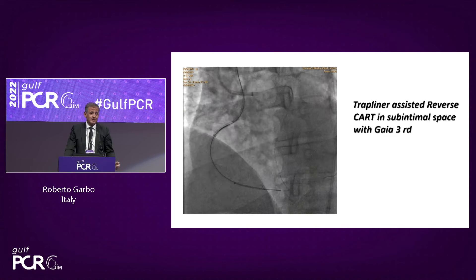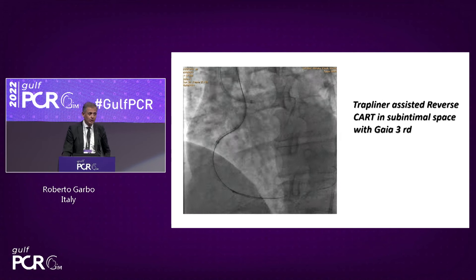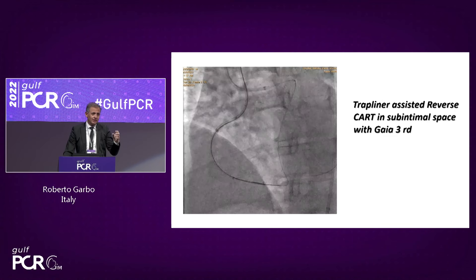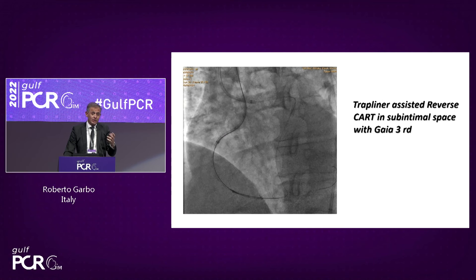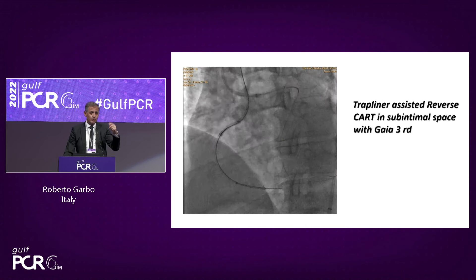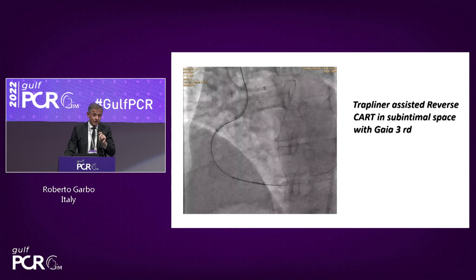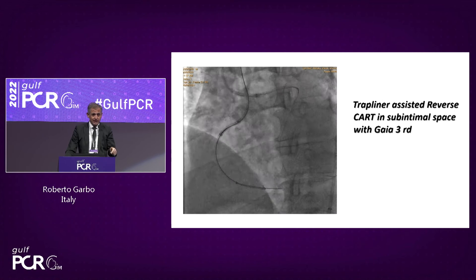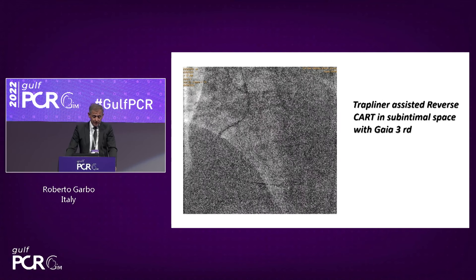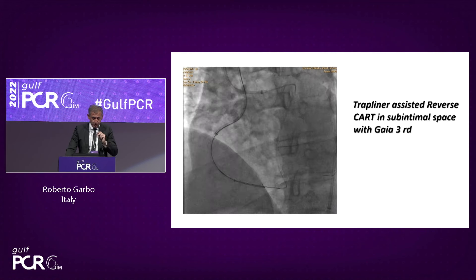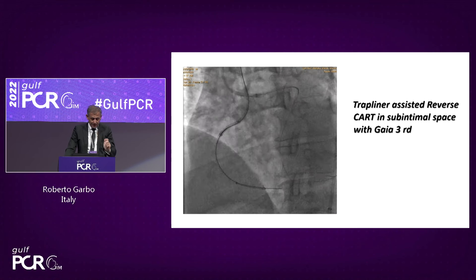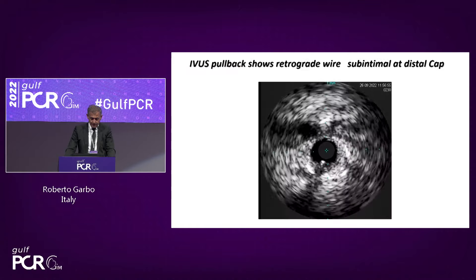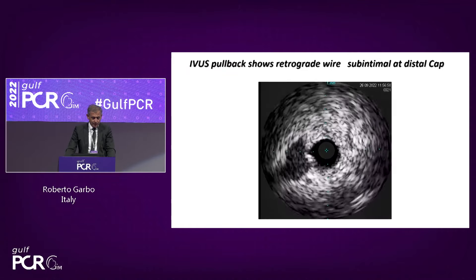Now with the guide extension, we put the Trapliner in the distal part of the right, make the connection there, and enter with the retrograde wire into the Trapliner distally. I performed a reverse CART in the sub-intimal space and was able to re-enter, as you can see, with the Gaia into the Trapliner. Then I performed externalization. This is the IVUS — only a small 2 mm balloon dilatation was needed to advance the IVUS. This is a Volcano IVUS — Philips Eagle Eye.